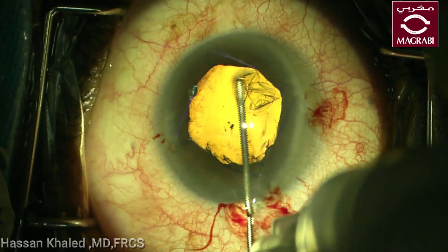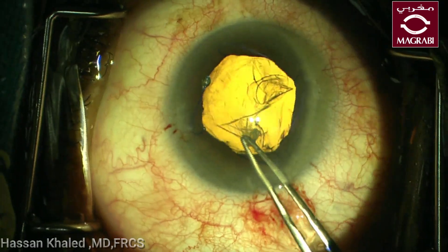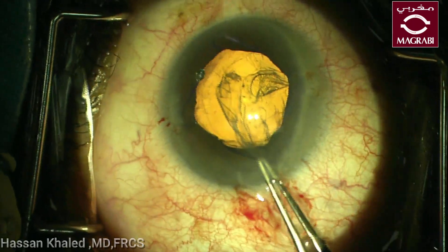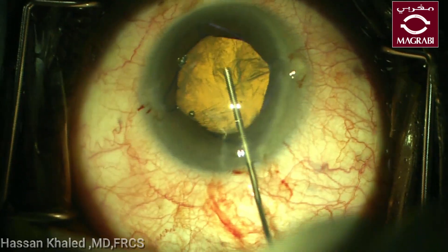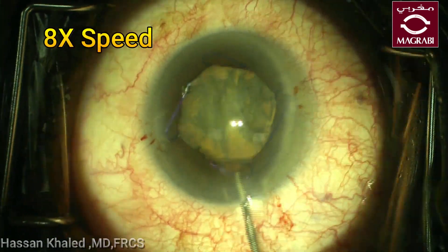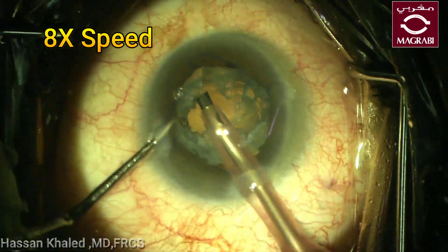Now dealing with this case became easier with this large pupil. You can see the pupil is now about six millimeters, using the system to create an anterior capsular incision, then completing the rhexis with forceps, then doing hydrodissection. Emulsifying this soft cataract — it was not a dense cataract — was easy.